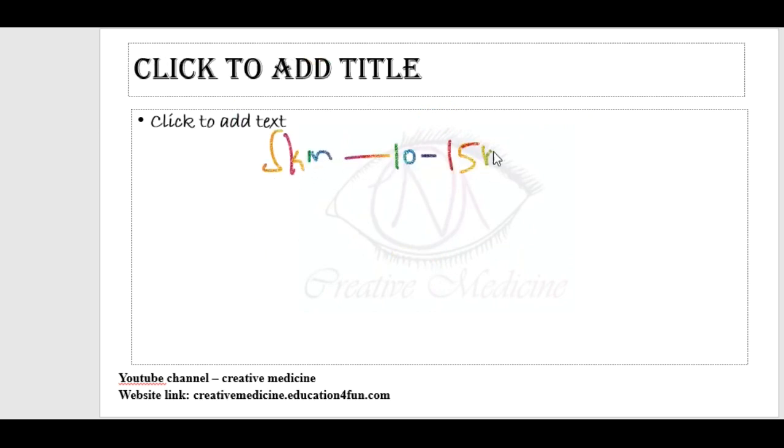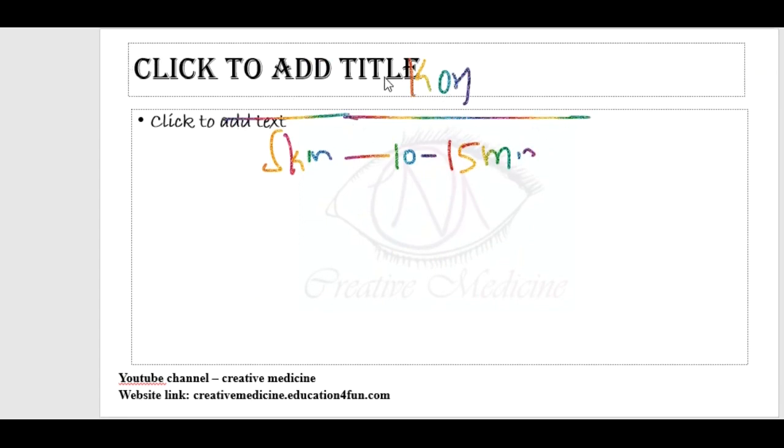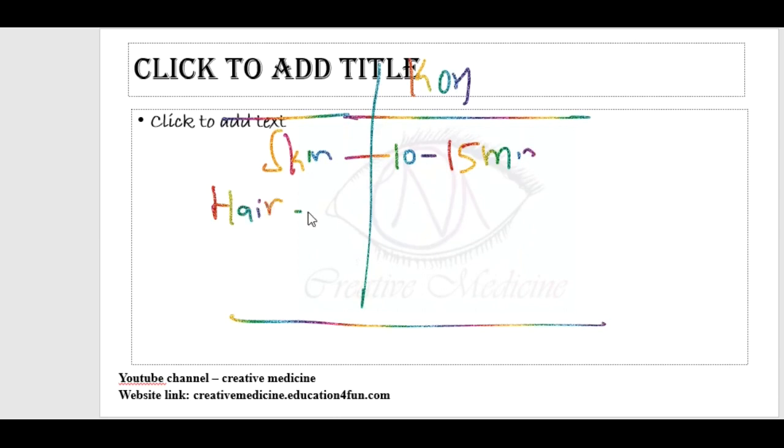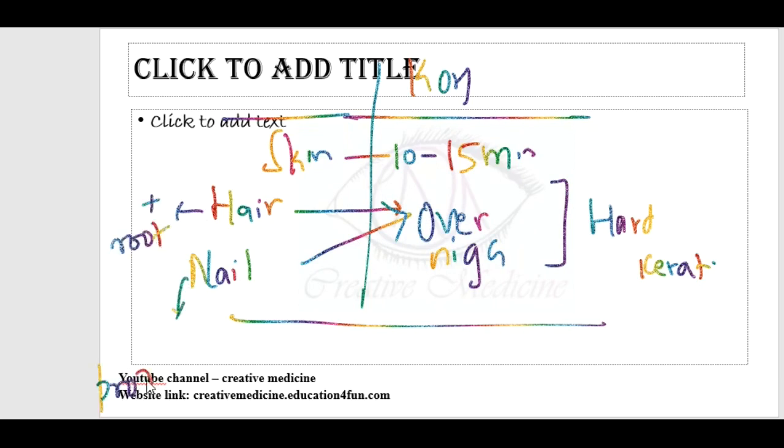Here in the KOH solution, skin is kept for 10 to 15 minutes, whereas hair and nail have more disulfide bonds. They have hard keratin. Because hair and nails have hard keratin, we should dip it in KOH solution overnight. Hair should be obtained by plucking the hair along with its root, whereas nail, mainly the proximal part of nail, is obtained through nail clipping.